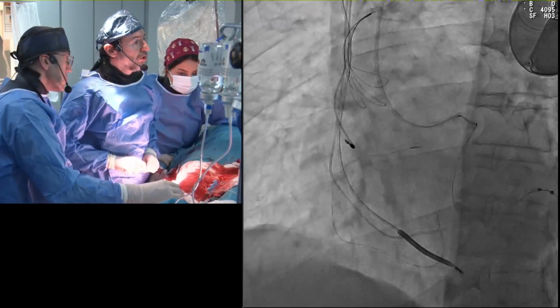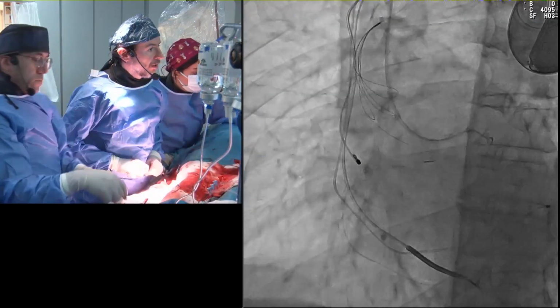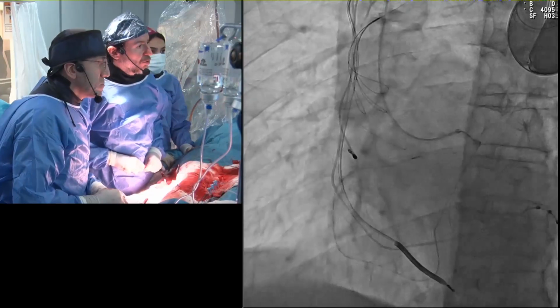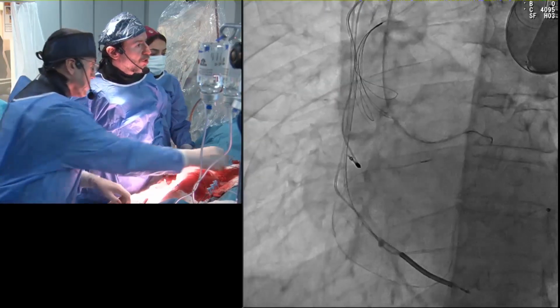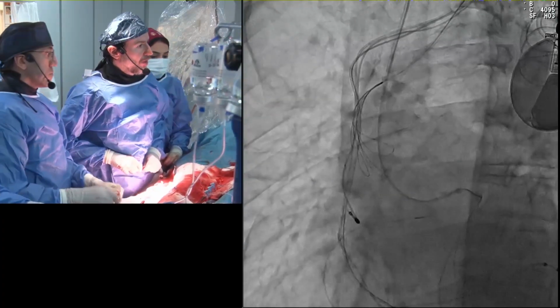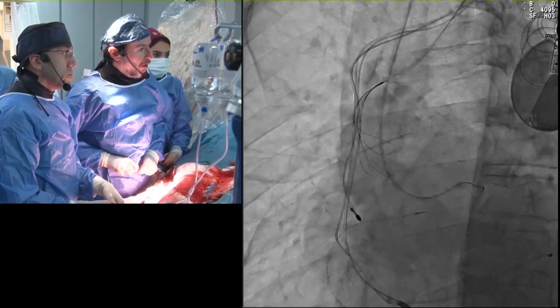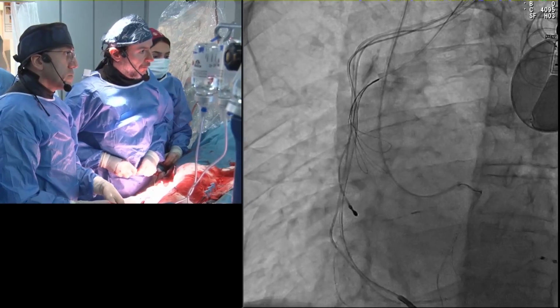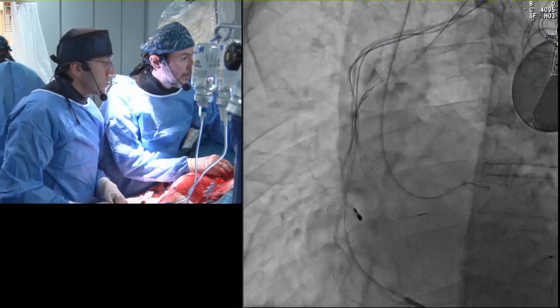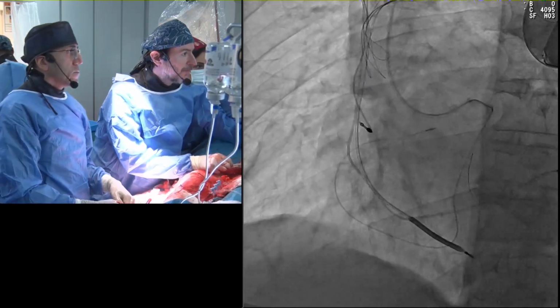It's in the snare. Pull it more, pull it more, pull it more. Now push it. Okay, so the microcatheter is also squeezed, it's not easy. I think there is an aortic course. The wire is not moving with the blood. Can you advance your snare more? Yep. And then after that, try again. Okay, yeah, perfect. It was good, I think.